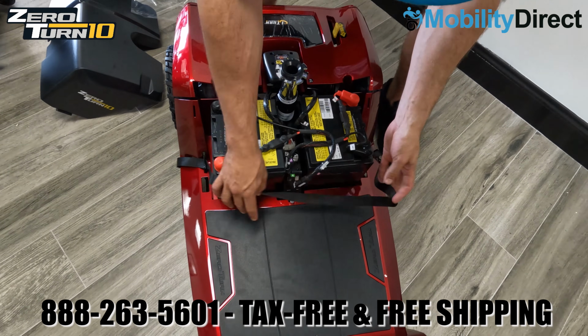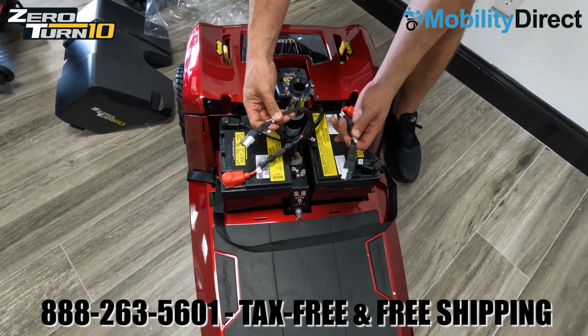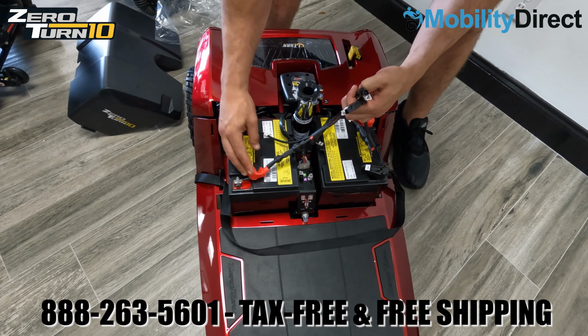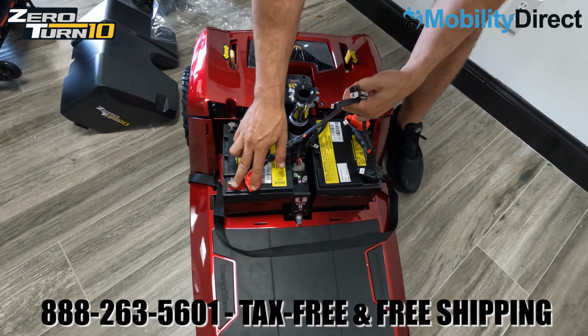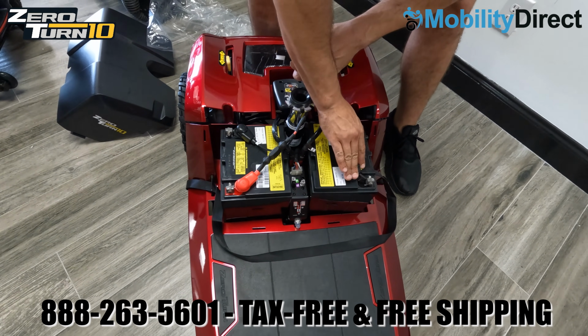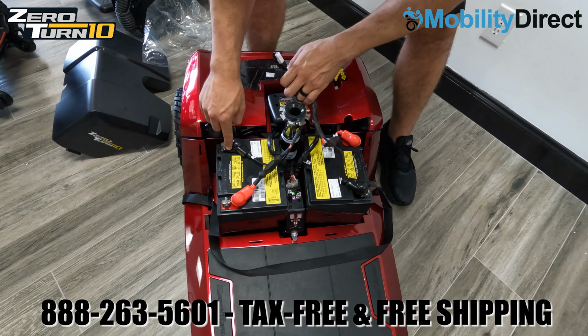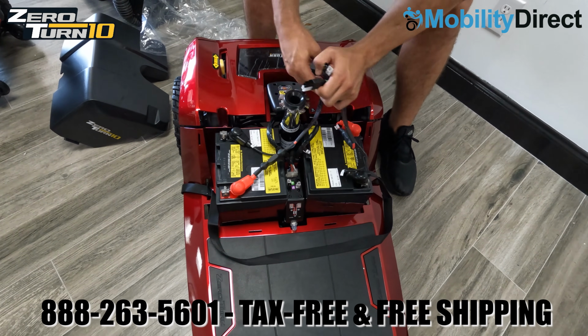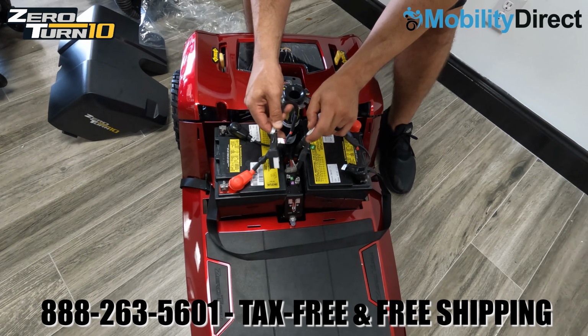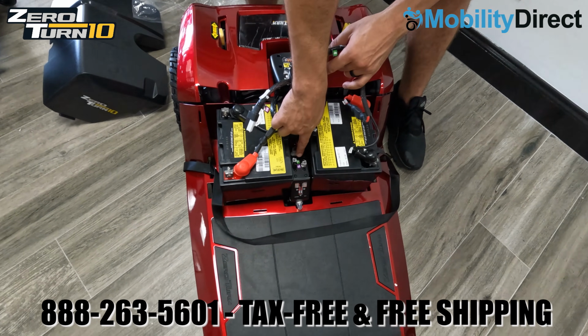We're going to go ahead and unbuckle the battery strap and show you that the batteries come pre-wired to the terminals, but there's a little connector on each end of the positive and negative wire kits, and those white and black harness connectors will need to plug into the scooter. So again, the terminals are connected, but the black and white clips are not plugged into the scooter.